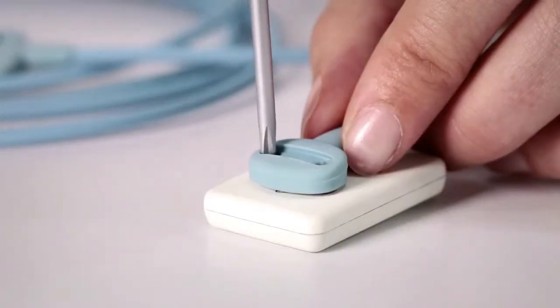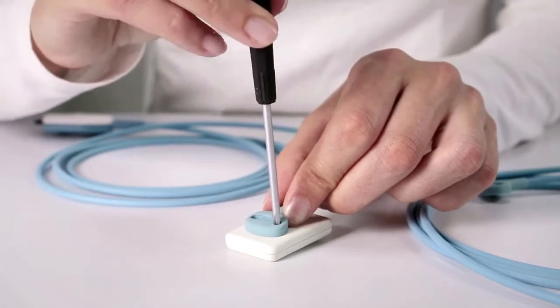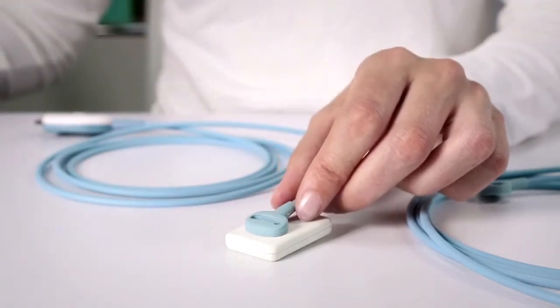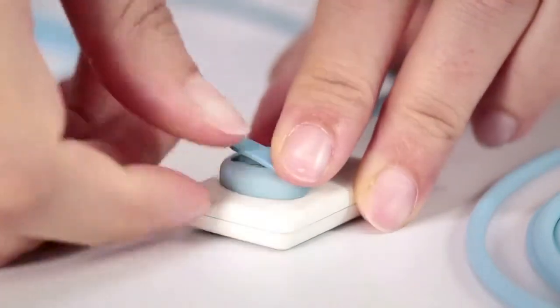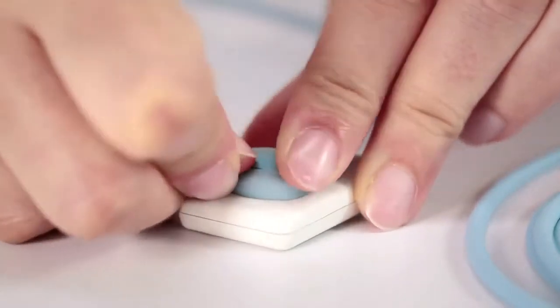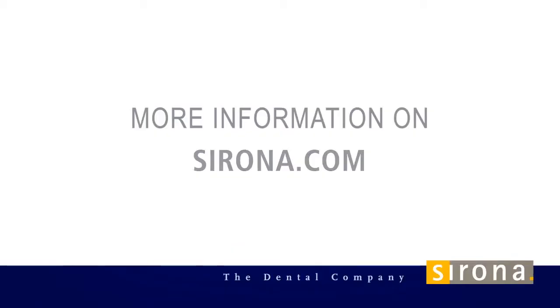In doing so, you have carried out all of the necessary steps to replace the cable within a short time. The new Xeos XG sensor is ready for the next application. Straightforward and economical — changing the cable of the new Xeos XG sensors is easy.